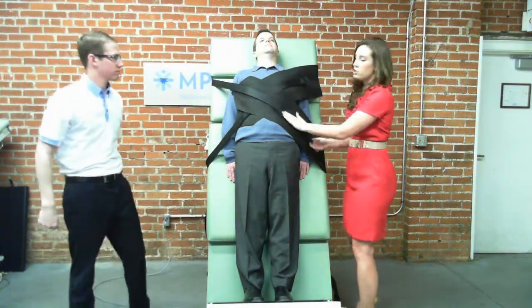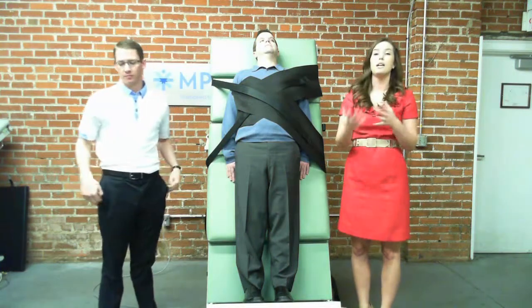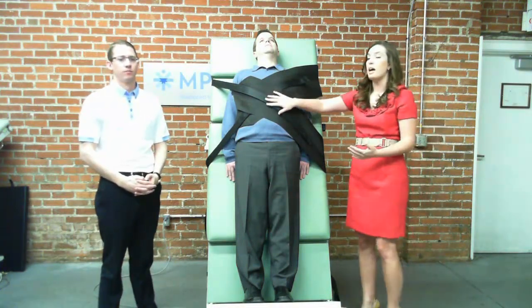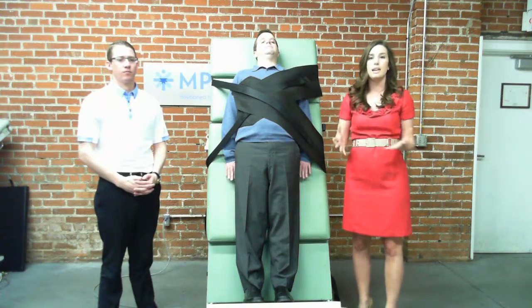You also have the strap down over the legs if you want to use that as well. And as we discussed yesterday, you can use additional blankets underneath the straps as well as stuffing pillows in the sides to keep your patient nice and snug.